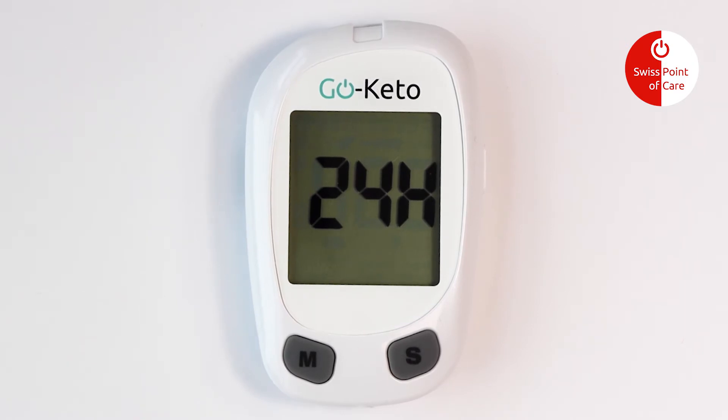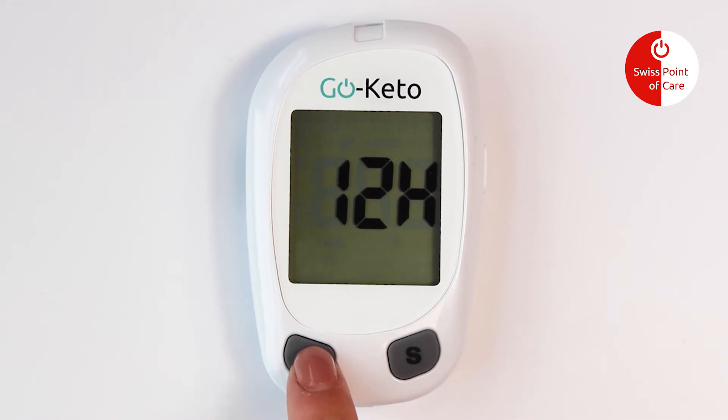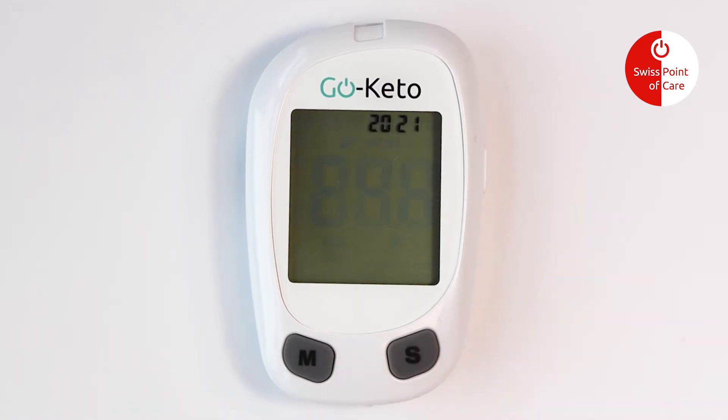Press the M button to switch between 12 and 24 hour mode, and then press the S button to save your choice.